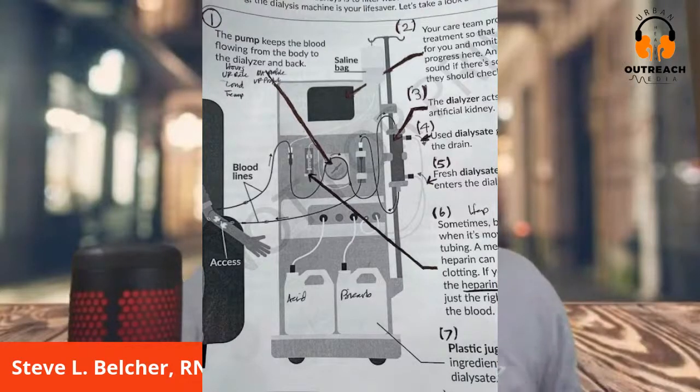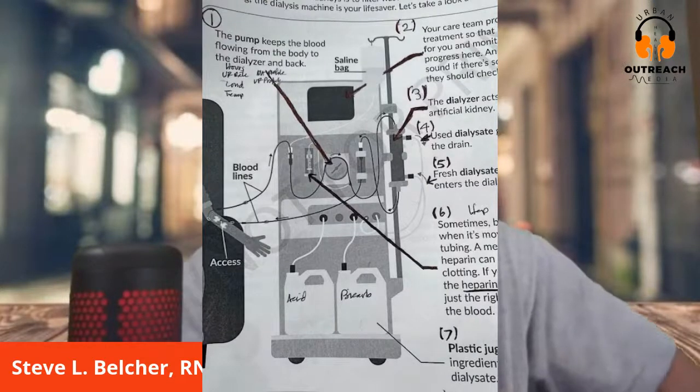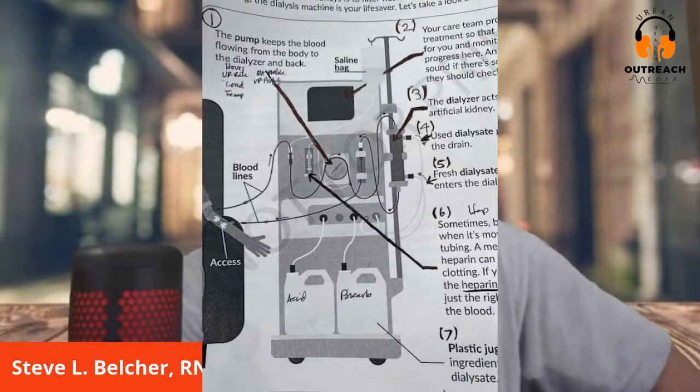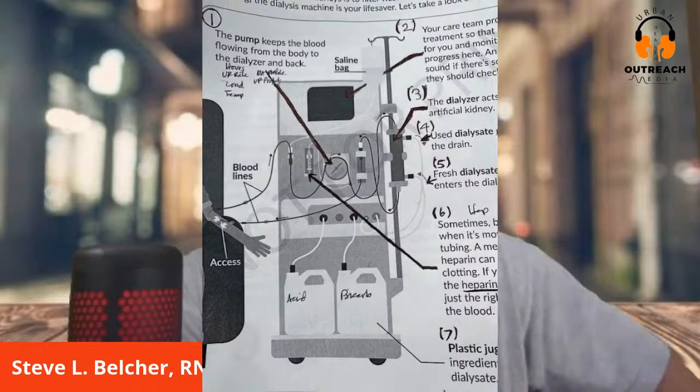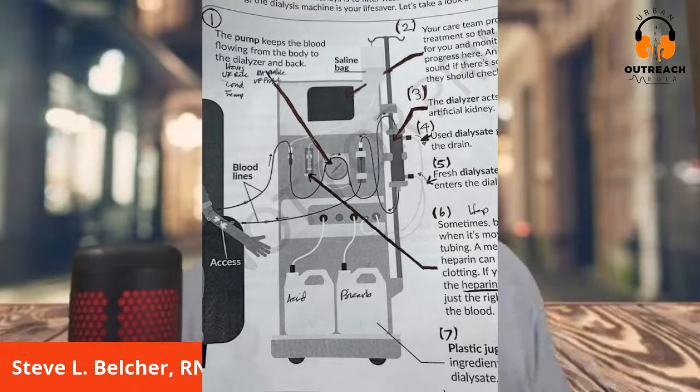Like I said, you're walking into the unit. You may be a patient, you may not, you may be a family member, and you see this machine, and you're like, damn, this thing looks really technical. Don't let that intimidate you. This machine is very simple. Once you get the principles down and understand it, you can apply this to the B. Braun machine, which is the machine that I had on the advertisement. That's the B. Braun Dialog, okay? But let's start from number one.